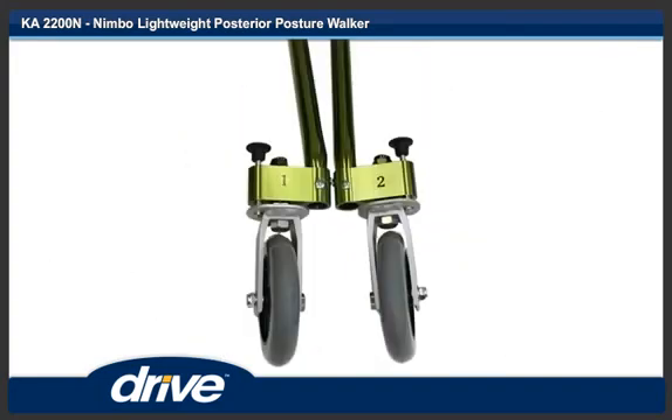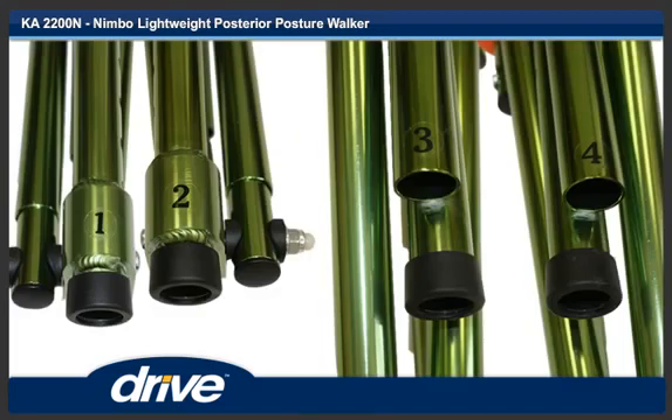Step 2. Each leg will have a number on it. Step 3. Each main frame leg tube will have a corresponding number.